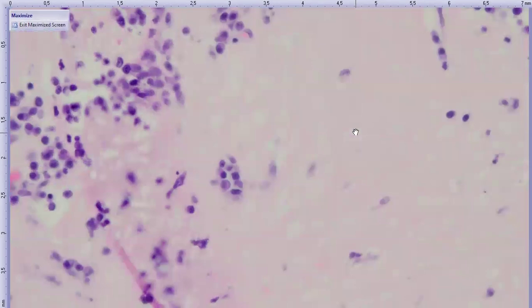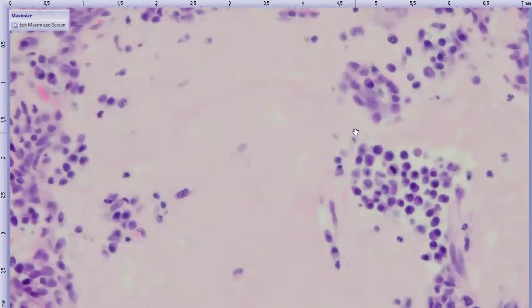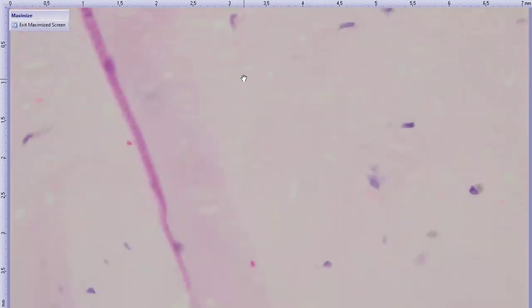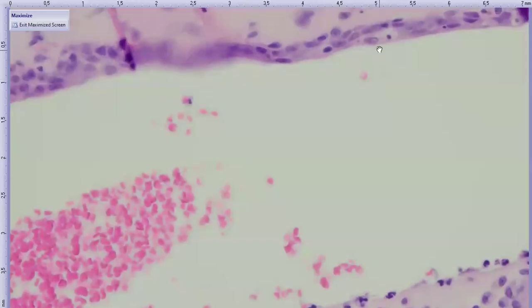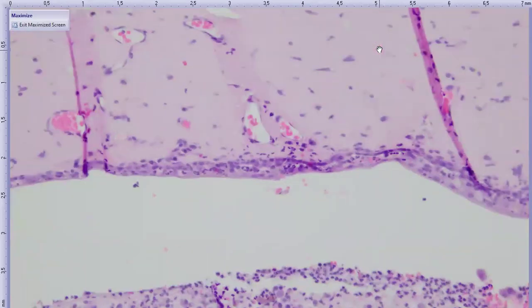And then this is all expanding the substantia propria, and included in here is this extracellular eosinophilic matrix that's acellular. As we go to the surface, we can see conjunctival epithelium here, a little mildly hyperplastic and sometimes attenuated over this material.